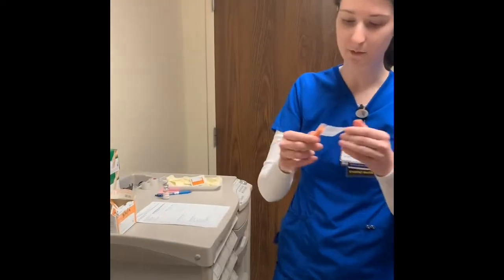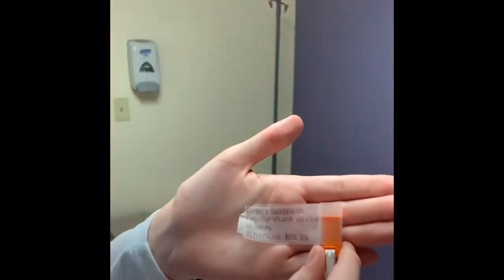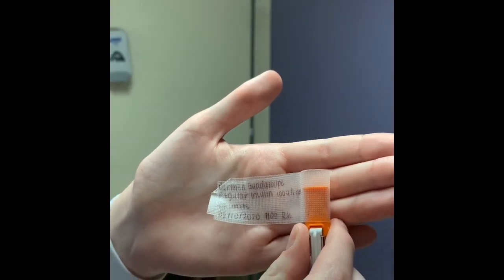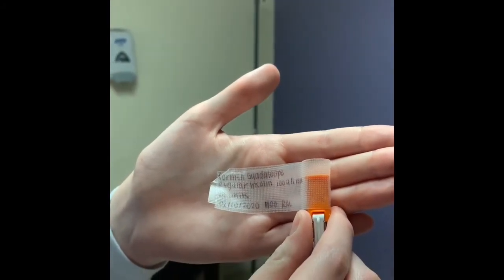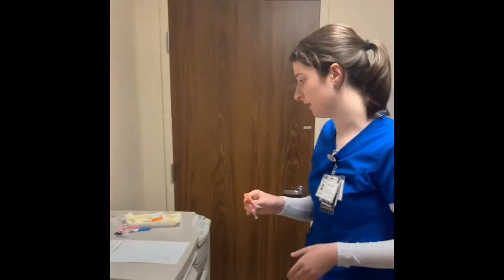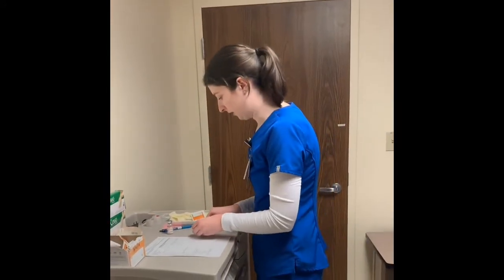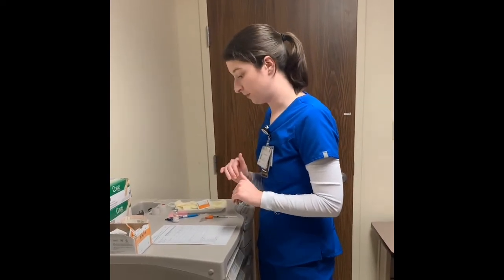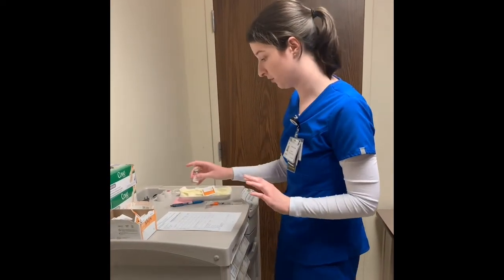So here is the label that I have made. It's for Carmen Guadalupe, regular insulin, 100 units per 1 milliliter, 20 units. Today's date, the time is 1100, and my initials. Okay, so now I have completed all of the preparation, so I should be ready to go into the patient's room as soon as I put this medication away.